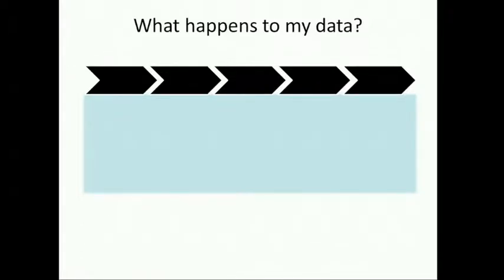So what this did say is, once you've acquired some imaging data on one of the MRI scanners, it gets pushed into a centralized server called XNAT, where your data is stored and backed up, so they're safely kept. You'll be able to access them in their raw format, and in addition you'll be able to run some pre-processing pipelines to get your data out in a usable format that includes some corrections for some of the artifacts that you might not want part of in your data. I think the detail of that is really the subject of another talk, so I'm not going to talk in a lot of detail.